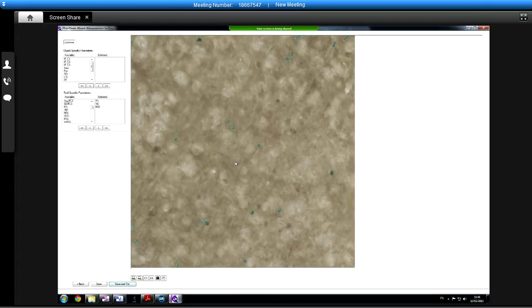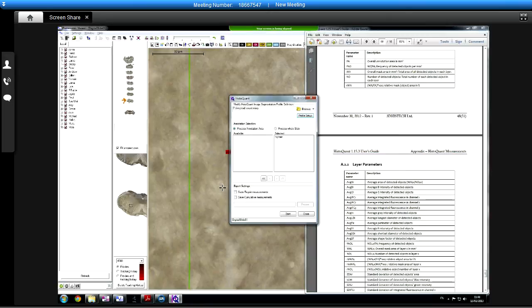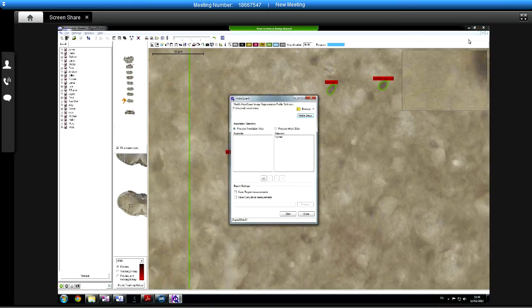From this point on, we could run it on that little area. All it would do is measure exactly what we already told it to measure, so it wouldn't learn anything new. So probably the next thing to do is to pick a bigger area, run it on that, and see whether, based on the area we chose to train it on, we're going roughly in the right direction. At the moment I haven't got anything marked up, so I'm just going to close that temporarily.